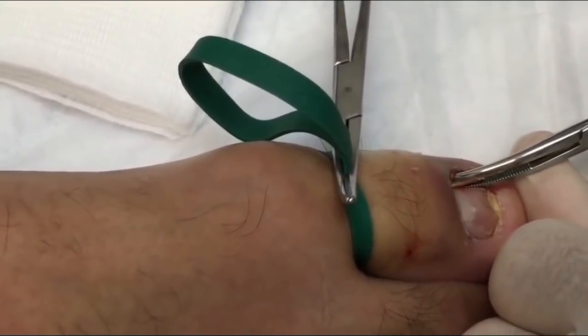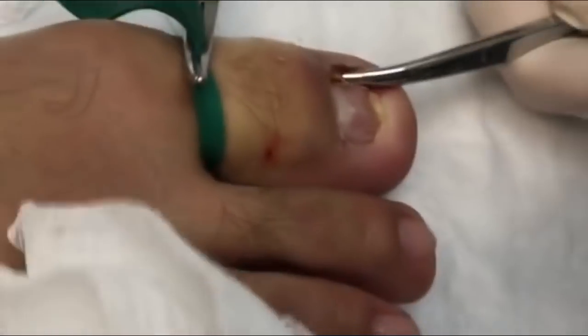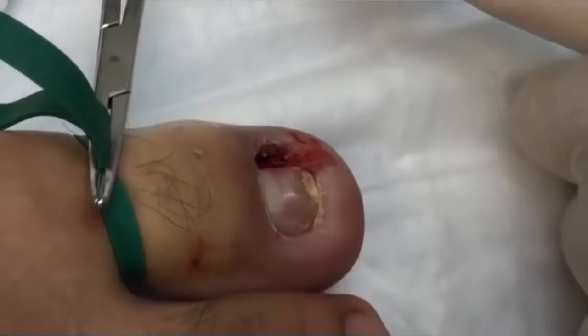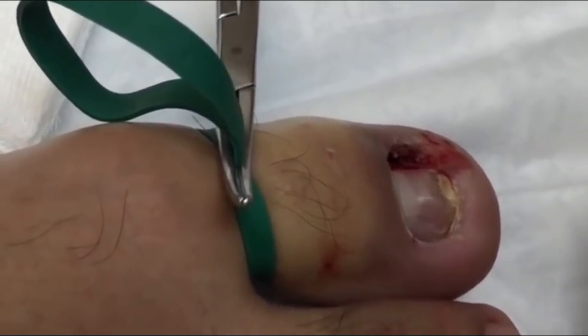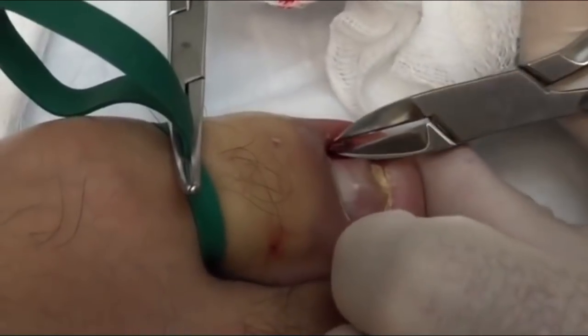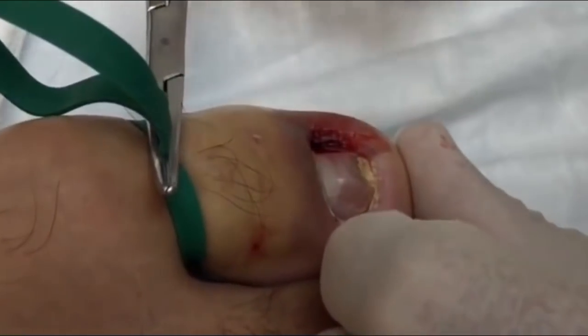So we're just going to use a hemostat now. Clamp down onto that. And so we don't spray goop everywhere, we just cover that momentarily. And that comes right down. So that's the ingrown portion of the nail. In this case, not terribly large, but enough to cause problems. And we do have a little bit of redundant tissue right there. You can see that. So we're going to just clip that off. Good. And that'll help this heal better.